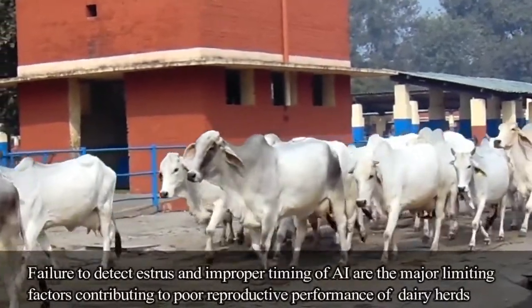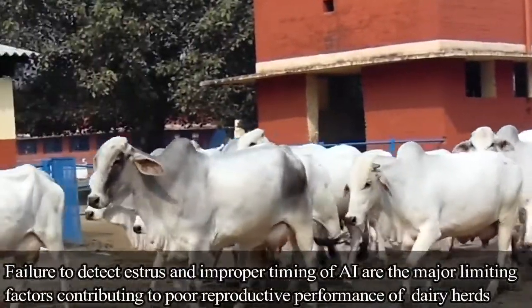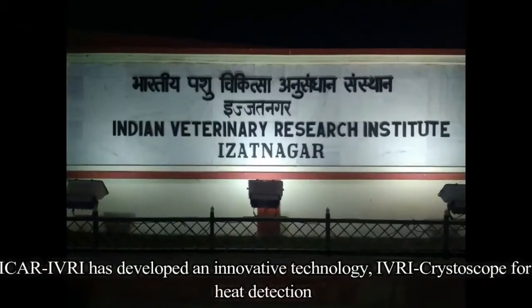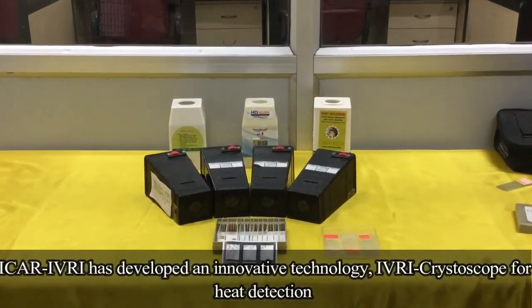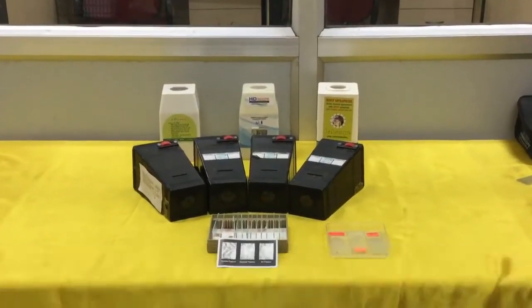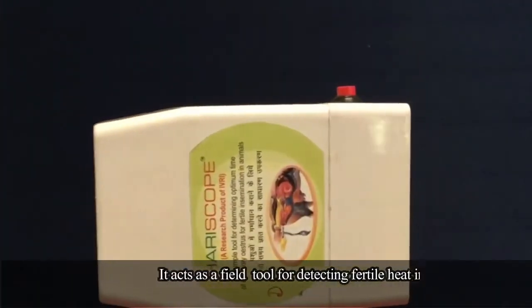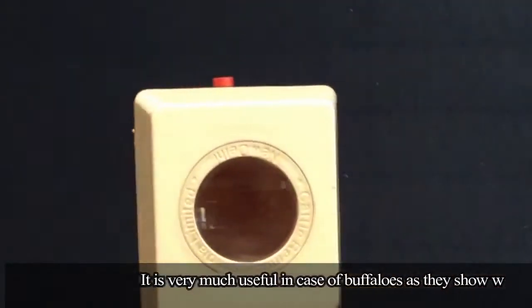Failure to detect estrus and improper timing of AI are the major limiting factors contributing to poor reproductive performance of dairy herds. ICAR-IVRI has developed an innovative technology, IVRI CrystalScope, for heat detection. It acts as a field tool for detecting fertile heat in animals, and is very much useful in case of buffaloes as they show weak signs of heat.